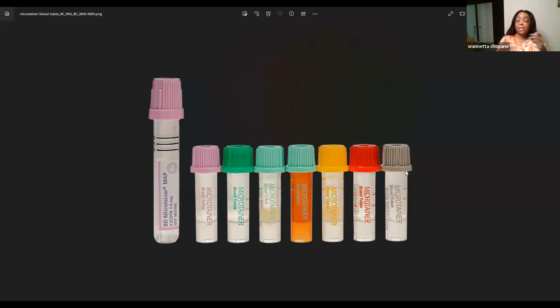There's no need to worry about cross-contamination because the blood is just dropping into the tubes, and they are really micro. It could be at least 10 drops of blood or so, with the hopes that the baby's heel is bleeding well. And that's why it's very important to warm the baby's heel, because if it's cold, like I explained to you, it'll be hard for the blood to drop, or it will take longer for the blood to drop.